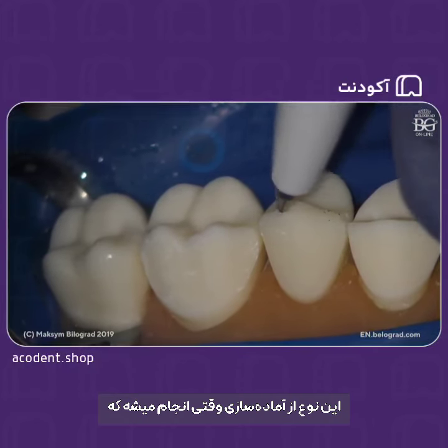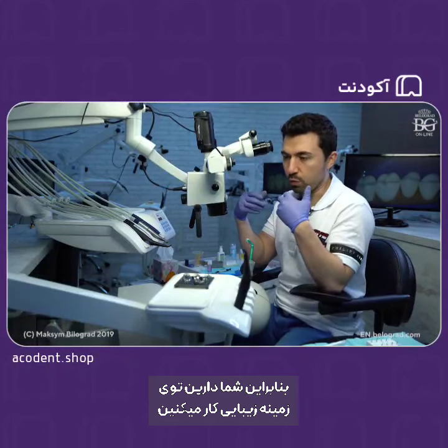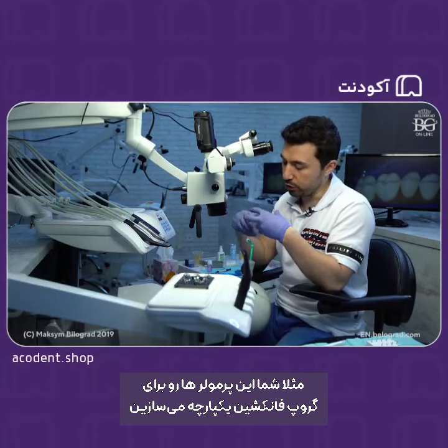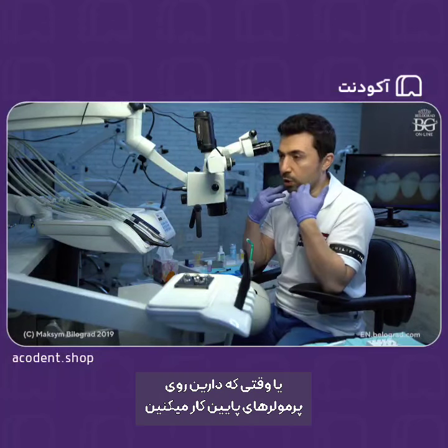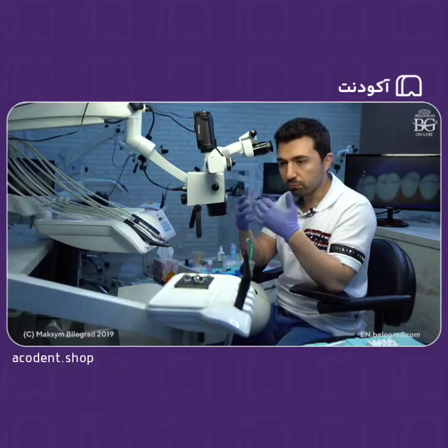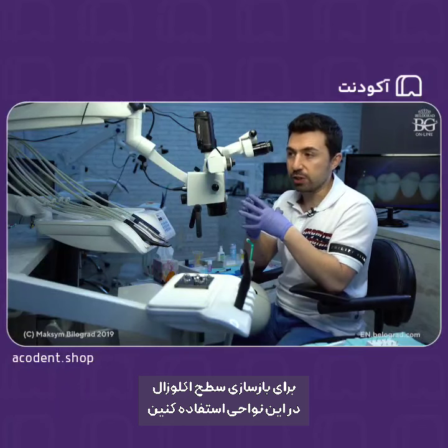So this type of preparation can be done when you need to make the tooth longer. So basically you work in the aesthetic area, making the tooth longer, and also you do some occlusal adjustments. For example, you integrate these premolars into group function. Or when you do lower premolars, and you know that the buccal cusps of lower premolars are more functional, you can do this type of preparation for some occlusal rehab cases too.